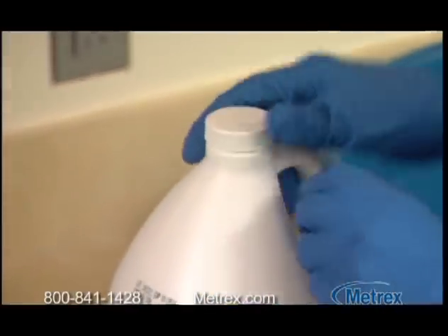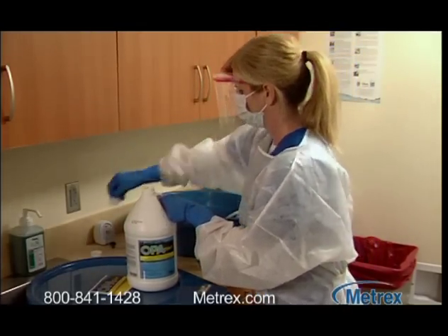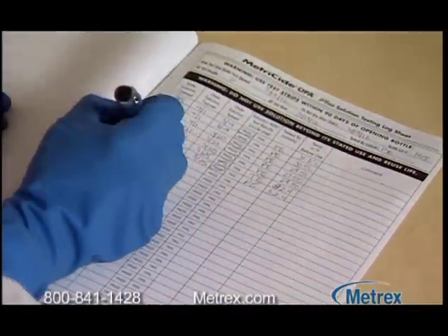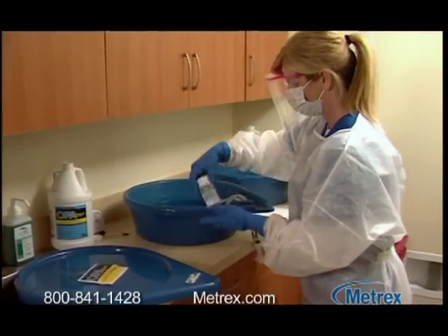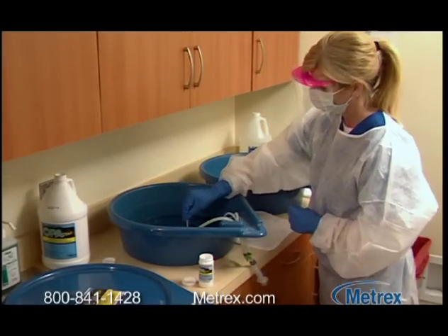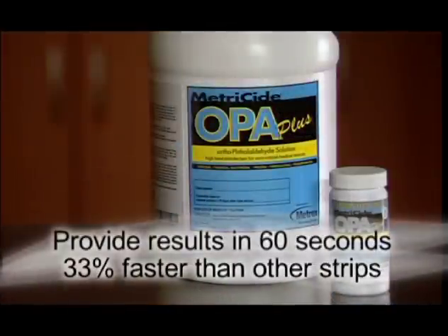Metricide OPA Plus solution can be used to disinfect semi-critical medical devices both manually and in an automatic endoscope reprocessor, or AER. When the container is first opened, be sure to record the date in a log book. If the entire container is not used, record the date on the container as well. To guard against dilution, use a Metricide OPA Plus solution test strip to verify the concentration prior to each use. Dip the test strip into the solution for two seconds, then shake off the excess solution. Metricide OPA Plus test strips provide results in only 60 seconds — 33% faster than other strips.